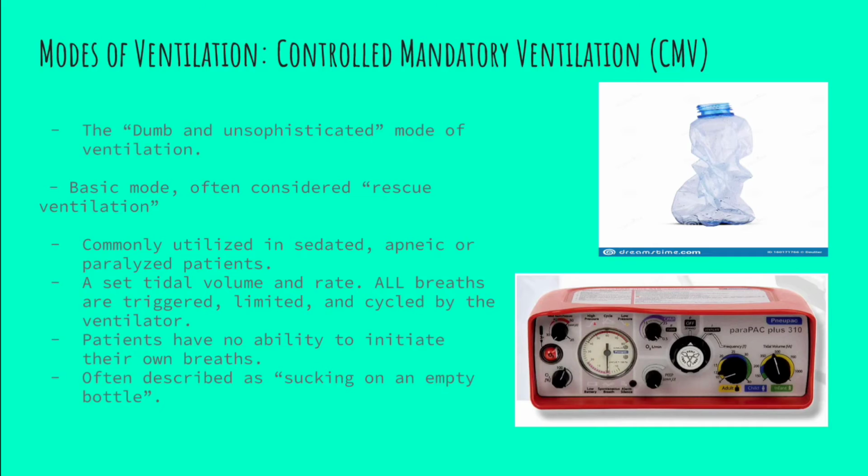So in a lot of cases with controlled mandatory ventilation, in the acute setting, it's completely appropriate because these patients are often heavily sedated and paralyzed. So this is an effective mode of ventilation. Now, if we take paralysis or sedation out of the equation, it makes ventilation rather difficult. It'll cause high pressure alarms, and it'll cause patient ventilator dyssynchrony, and it can cause breath stacking, which can be rather harmful.